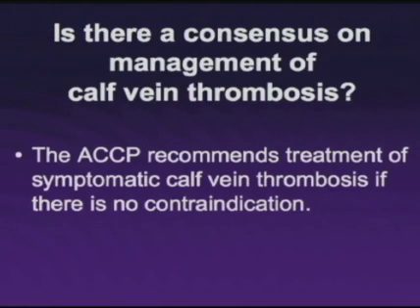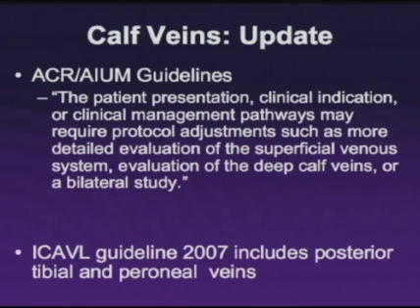The American College of Chest Physicians, again, recommends treatment, and recognizing this, the guidelines for the various agencies have varied. And so the ACR and the AIUM guidelines, which are current, state that the patient presentation, clinical indication, or clinical management may require protocol adjustments such as detailed evaluation of the superficial system or evaluation of the deep calf veins or a bilateral study.